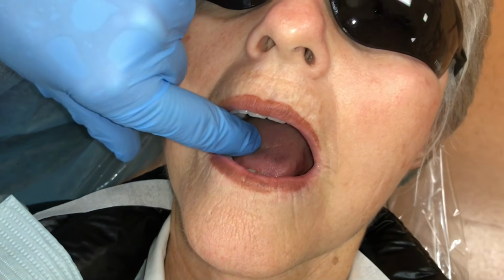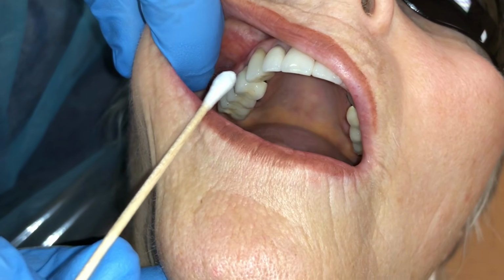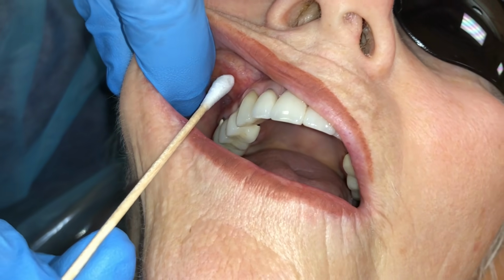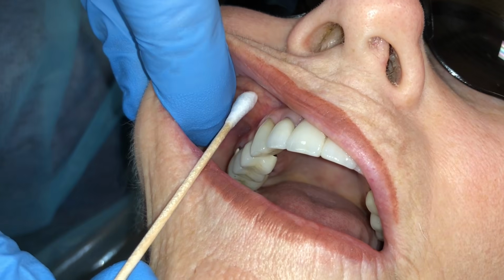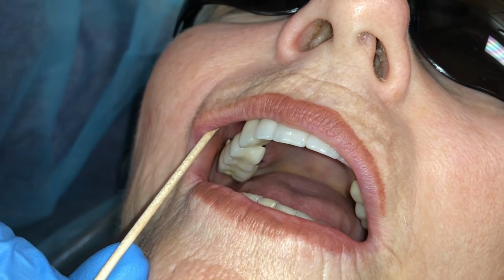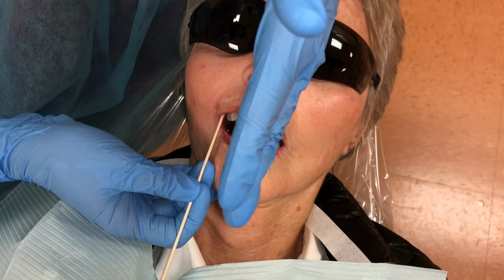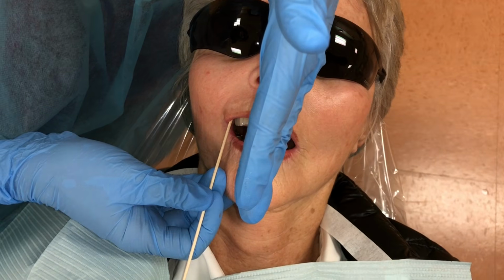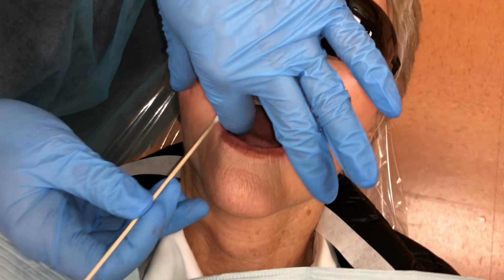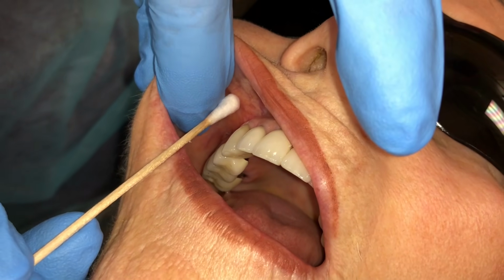The infraorbital nerve block penetration site would be at the height of the mucobuccal fold directly over the first premolar. The syringe barrel will be placed parallel to the mid-sagittal plane as indicated in the video. The depth of penetration would be approximately 10 to 16 millimeters.